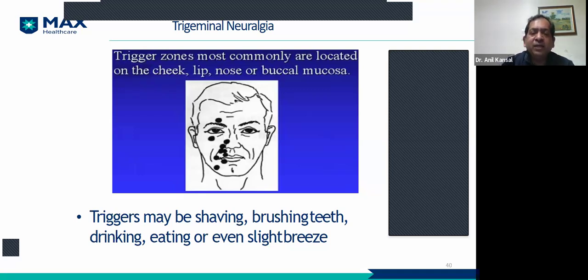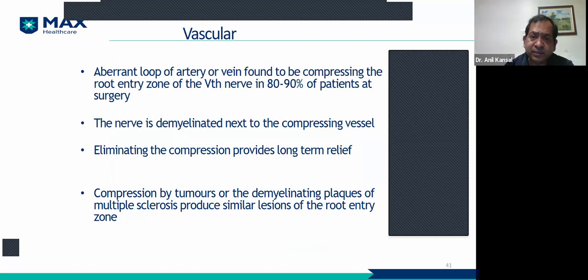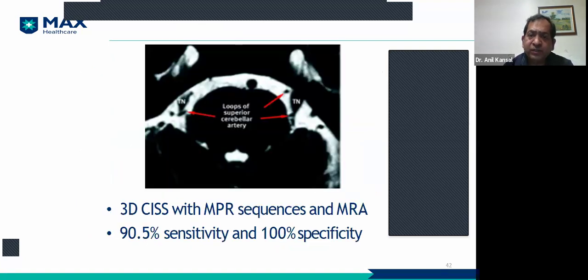Okay, these kind of patients. Now we do microvascular decompression surgeries. What we do, you can see the vascular tissue compressing the nerves. So we have to find out the different offending culprit arteries, and then we localize it.